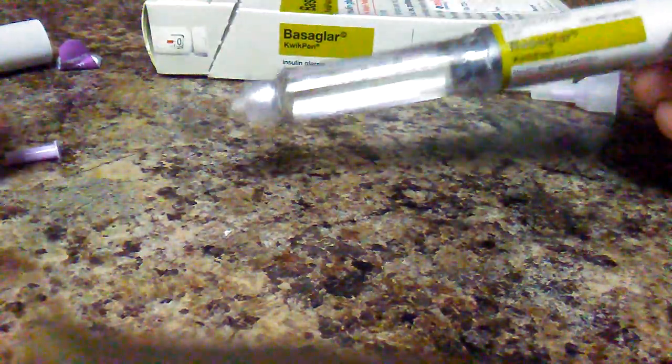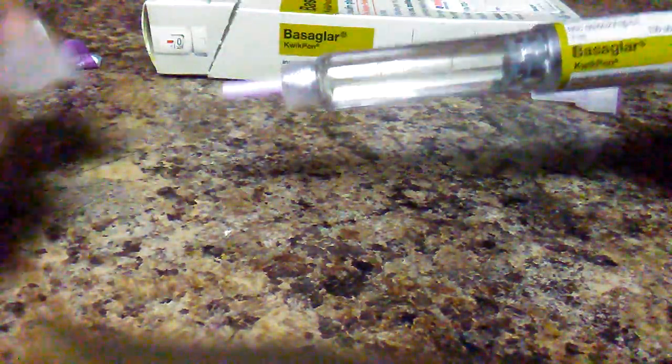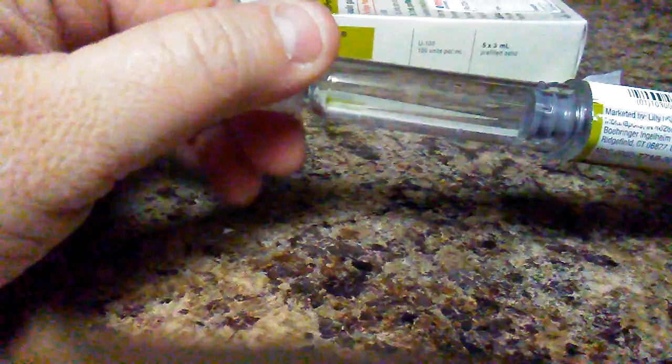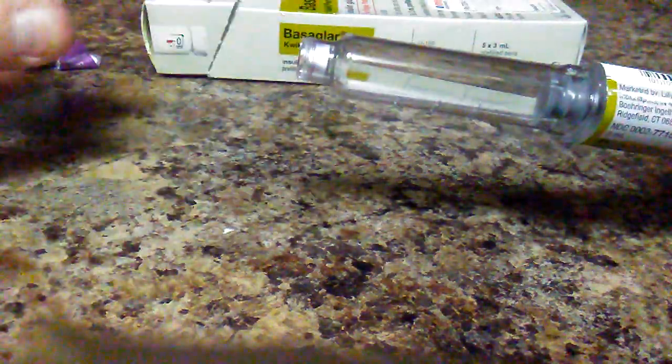And that's all. Then put the lid back on — just put this cap back on like that, put this cap back on, and you just turn it to the right.